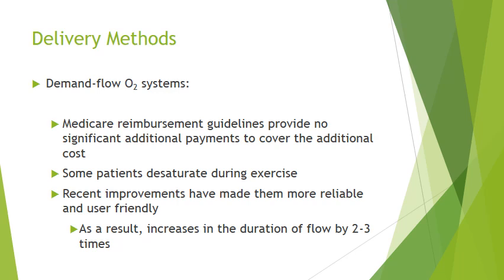Medicare reimbursement guidelines provide no significant additional payments to cover the additional costs for the demand flow system. Like I was saying before, the demand flow is good for patients who do not have a high oxygen need.